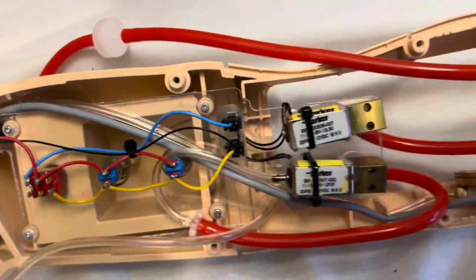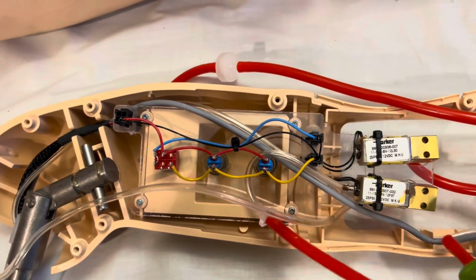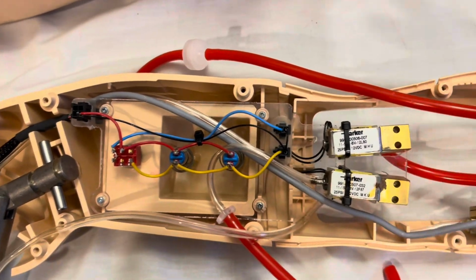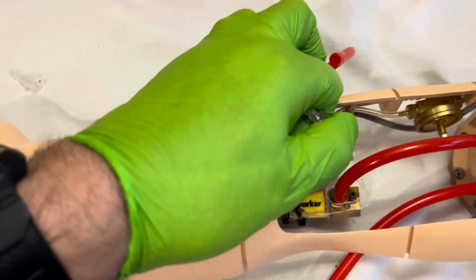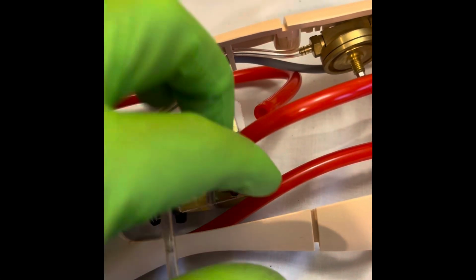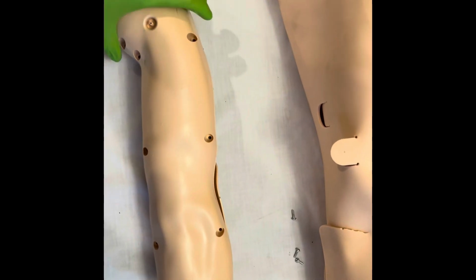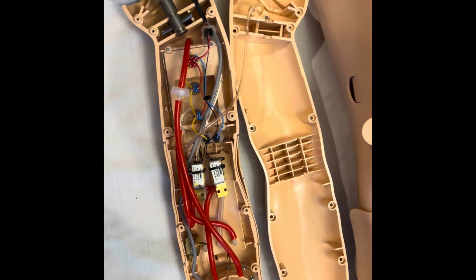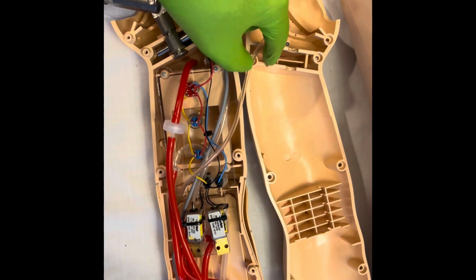Okay, next thing we want to do is grab the hose that's going to the exit port. We're just going to take it out of the valve here. Once that comes out, go ahead and grab this other hose here and take that out. I'm using my needle nose pliers to get a little brace and take that up. Once you've taken all the screws out, just take the cap and lay it to the side. The screws might fall out, that's okay. So release the hose here that's clamped up in this seat.